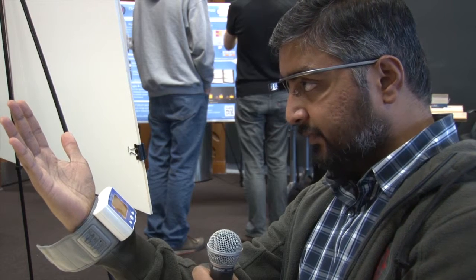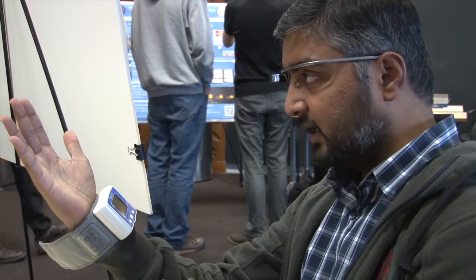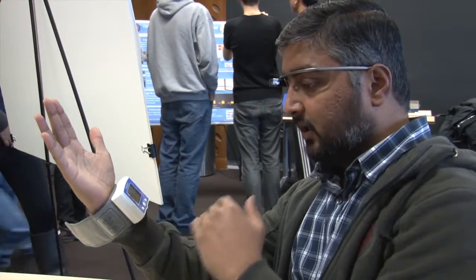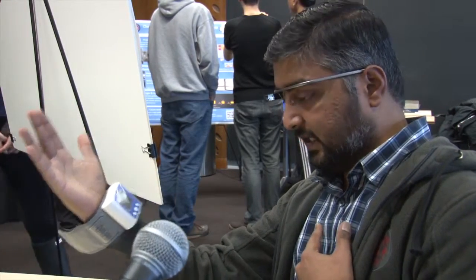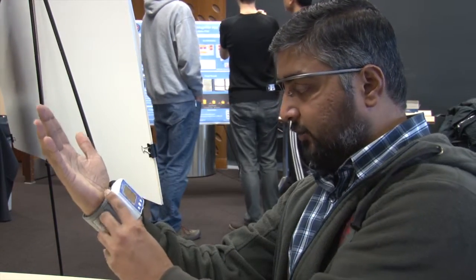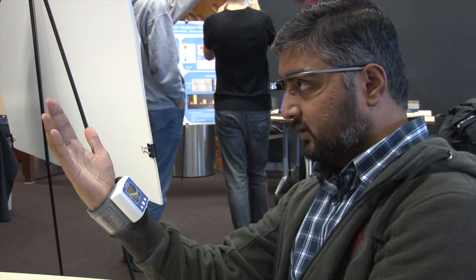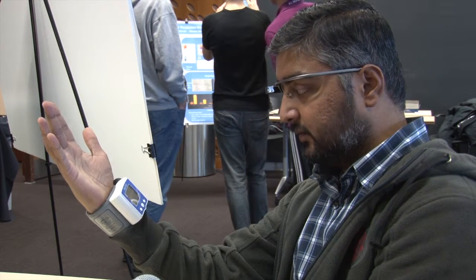Okay, Glass assistant. It is now asking me to place the hand over my heart and ensure that the level of the monitor is at this level. It is now asking me to press the center button to start the measurement. It will require me to say OK Glass and OK Glass Assistant once the measurement is complete.